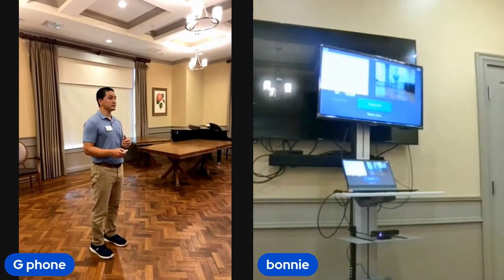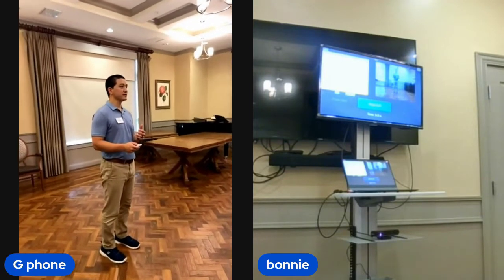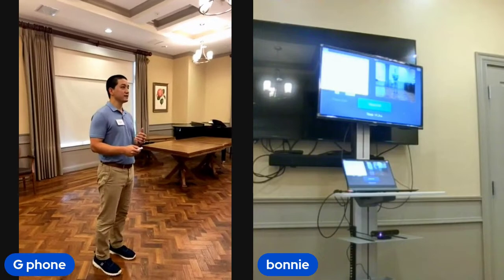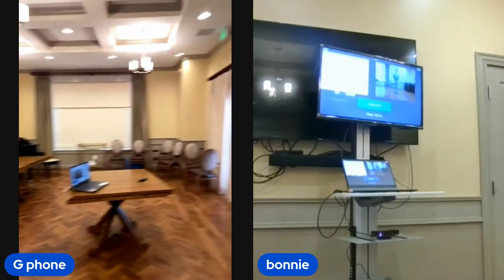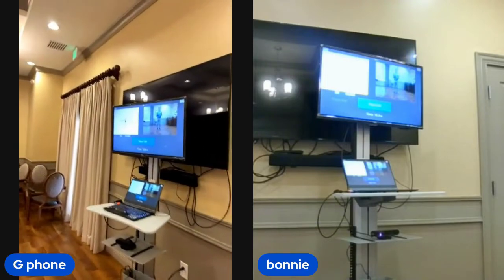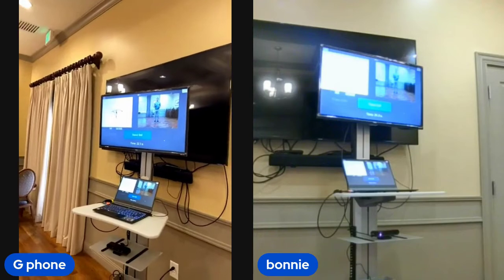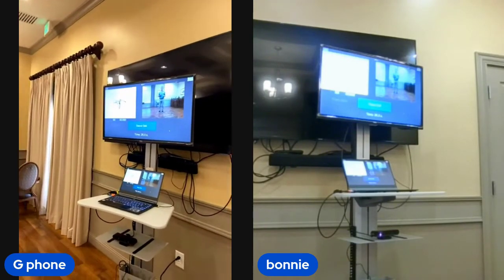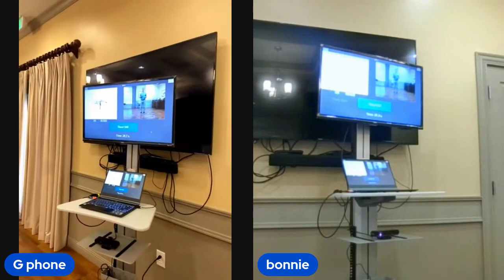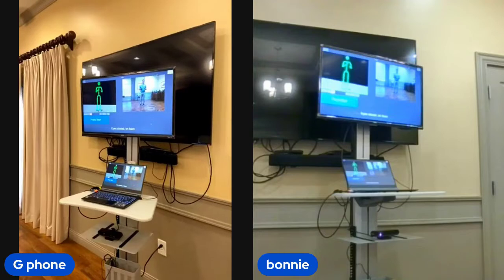For 30 seconds, they're going to hold themselves in space, and this little target will indicate if I'm leaning. So if I lean really far to the left, you can see that. Or if I shift my weight back on my heels, it'll show that. If someone's really unsteady, it's going to look like this, back and forth. And it's recording all of this the whole time. And the more steady they are, it's going to sit right here in the middle. And so you can see if they favor one leg. Nice. And that saves the data.